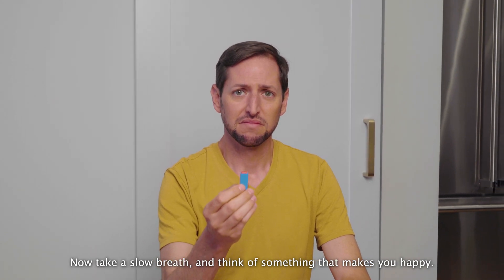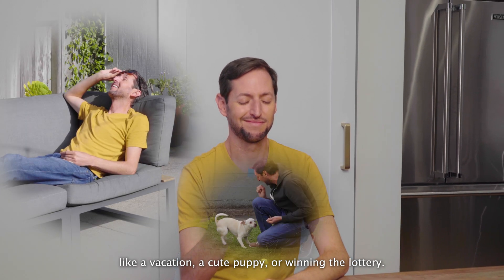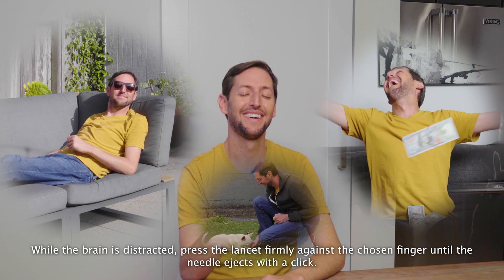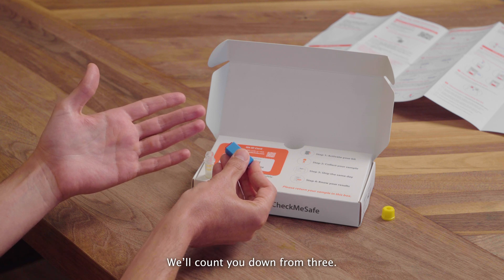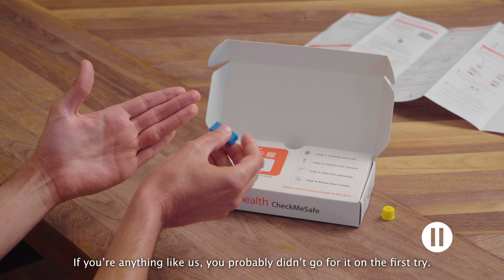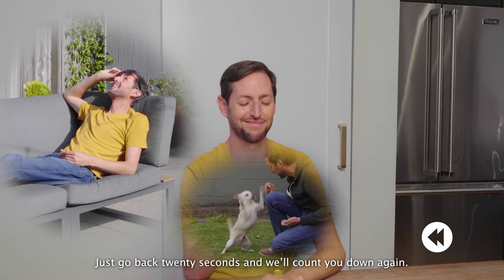Take a slow breath and think of something that makes you happy — like a vacation, a cute puppy, or winning the lottery. While the brain is distracted, press the lancet firmly against the chosen finger until the needle ejects with a click. We'll count you down from three: three, two, one. If you're anything like us, you probably didn't go for it on the first try, and that's okay. Just go back 20 seconds and we'll count you down again.